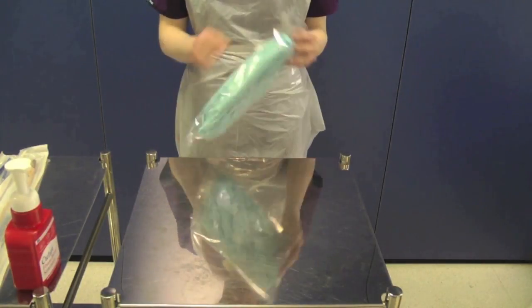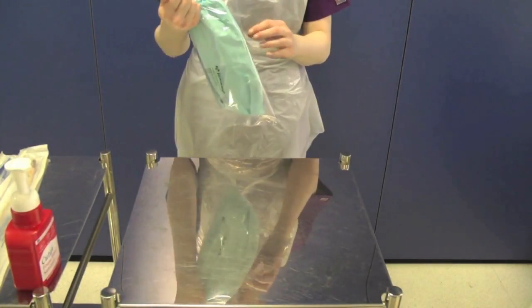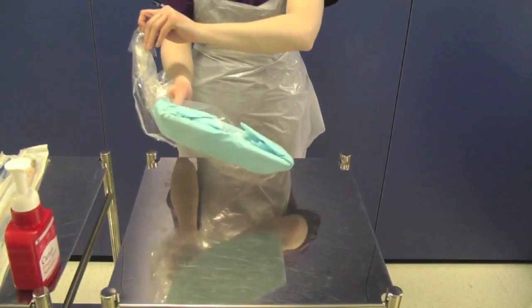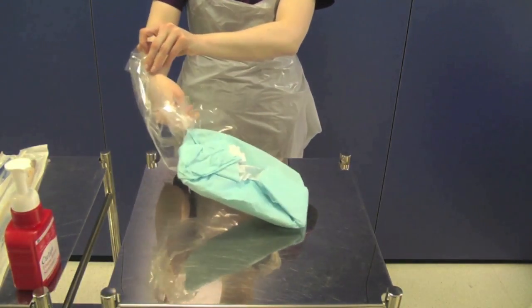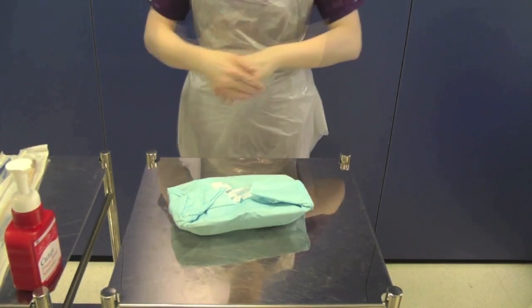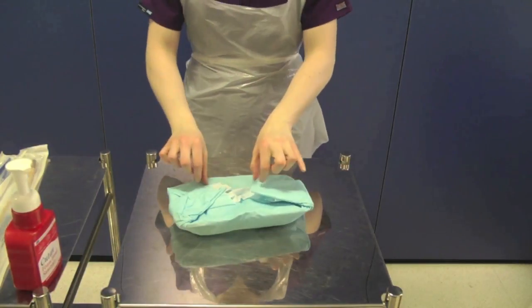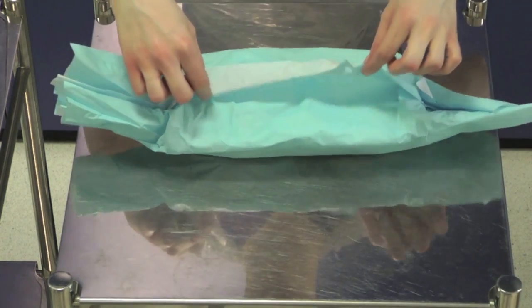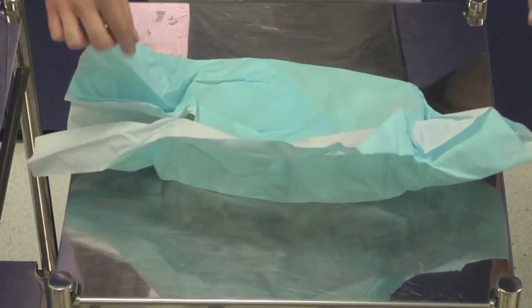Take your catheter pack and check that it is in date. Open the pack onto the trolley without touching the contents. You must decontaminate your hands as you have been touching outer packaging. Carefully open up the sterile catheter pack, opening the pack away from you first of all.